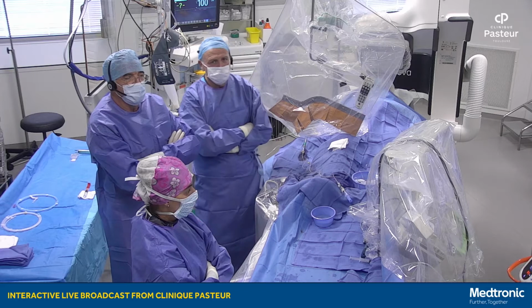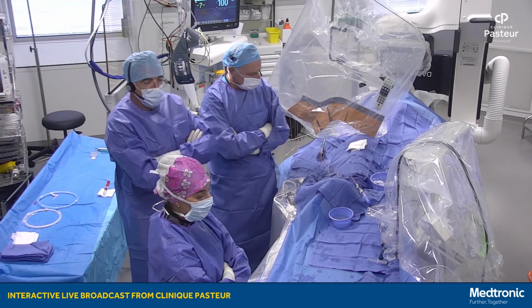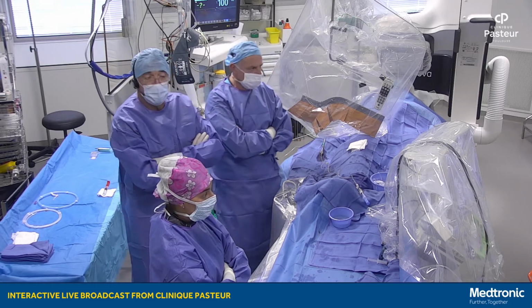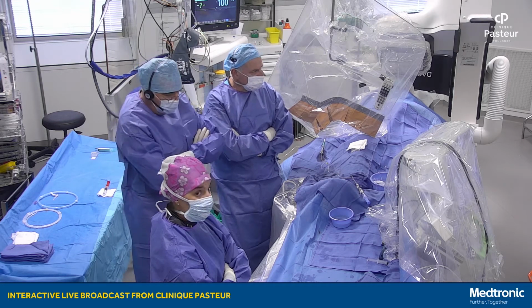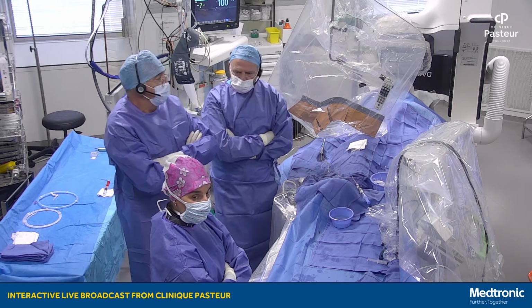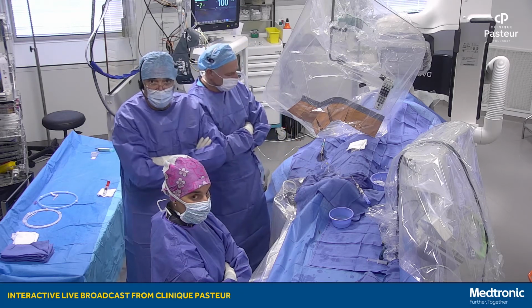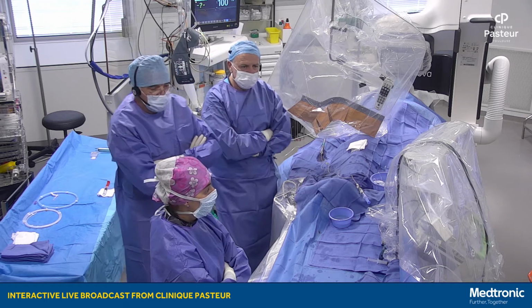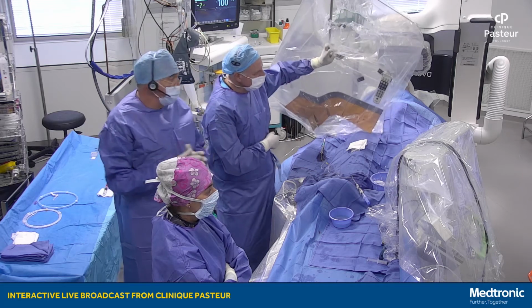And we will focus today on the treatment of a really complex bifurcation lesion. In addition, we will have to evaluate by intracoronary imaging, using the OCT, a lesion on the left main trunk. So we will be together for 45, 50 or around 60 minutes for the transmission. Do not hesitate to send us any questions you have. And Bruno will present you the case.